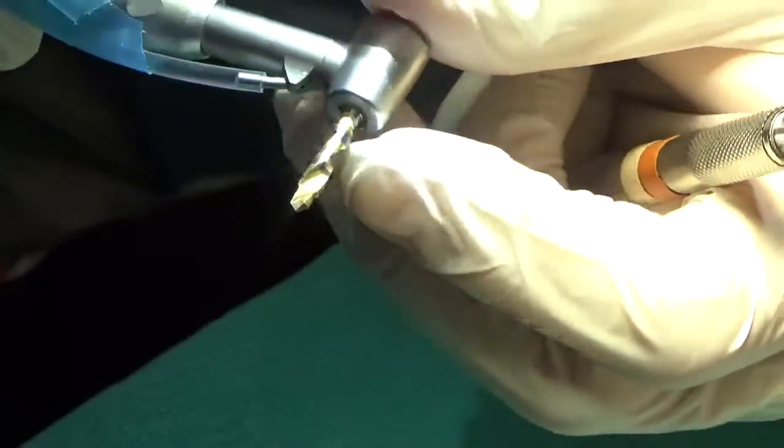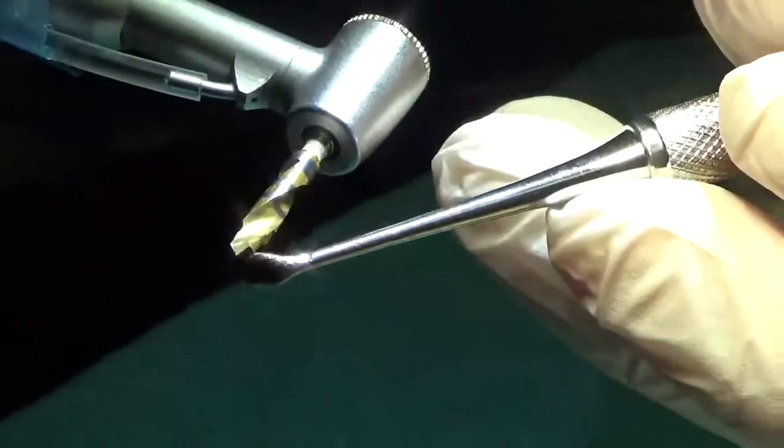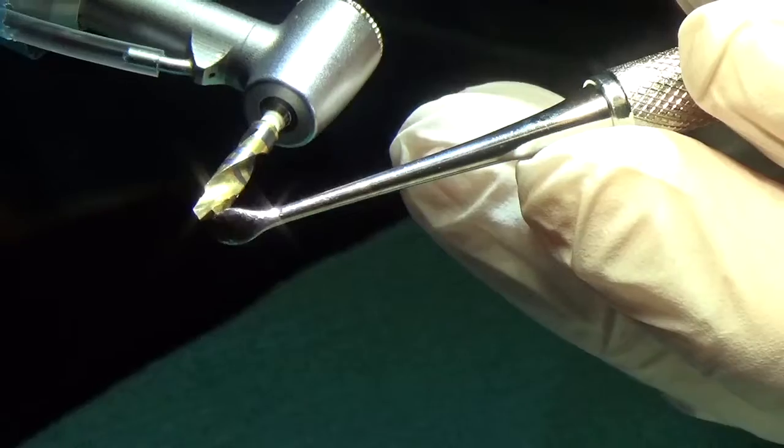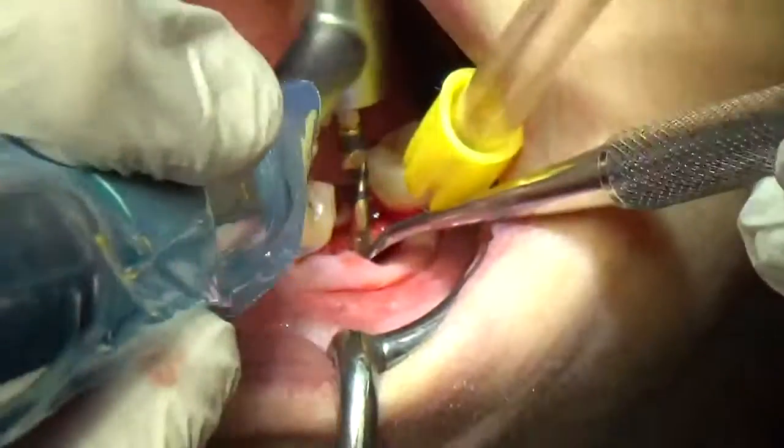Right here, turn it like that. There's a little indentation right at the apical aspect of that. And that right there allows for better seating into your previous osteotomy. And it should kind of pop right in there.